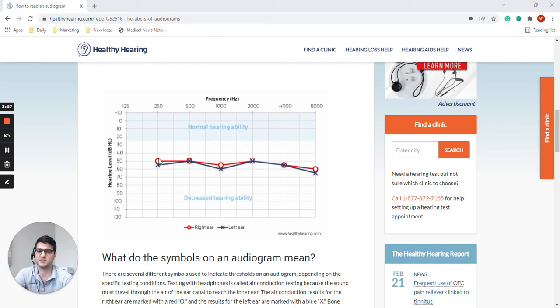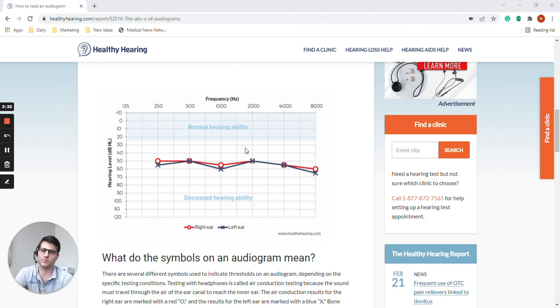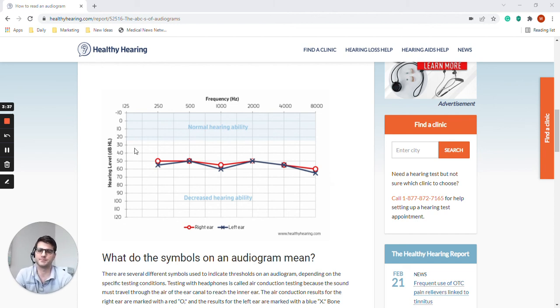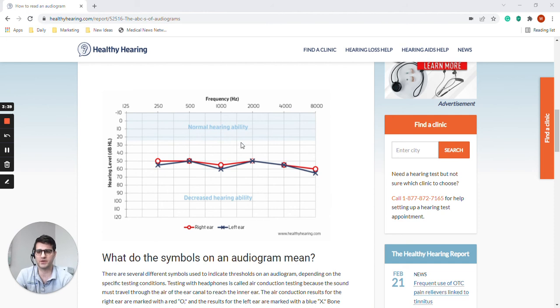Most places you may go, most hearing care professionals, this may be all you get. And they may use it as a hearing aid candidacy exam. You could fit a hearing aid using this information.